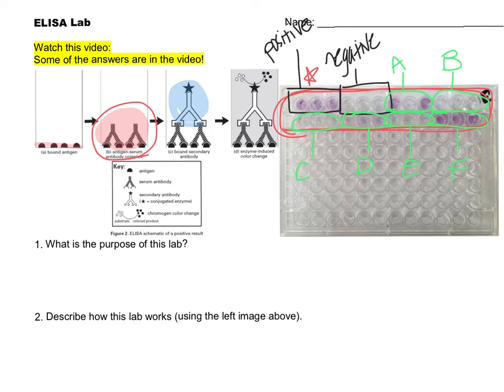So you can think about, why would we test something more than once if we're looking to determine if a person is infected or healthy? So for example, these F wells all are the same patient, patient F. We just did 3 identical tests on them.